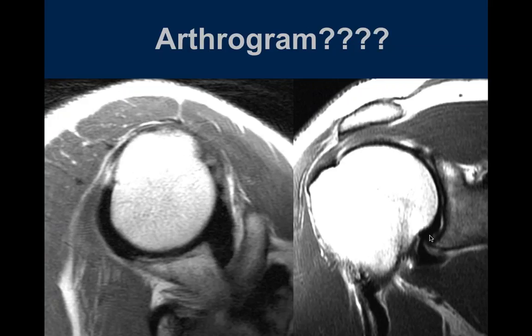But John, if you inject air, doesn't it dissipate pretty quickly? Well, air will stay in quite a while. When we first did arthrography of the shoulder, we actually did air arthrograms, and it stays long enough to be able to do the imaging. In this particular case, this is fluid, but remember, fluid can be either liquid or gaseous. But if you have a tear, air probably escapes pretty quick, though.